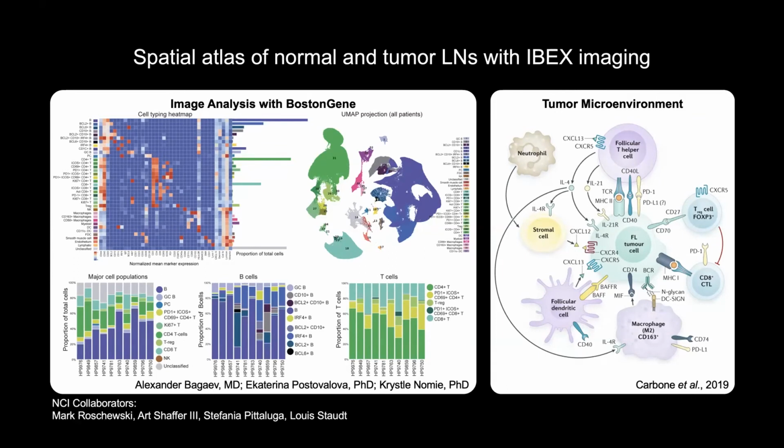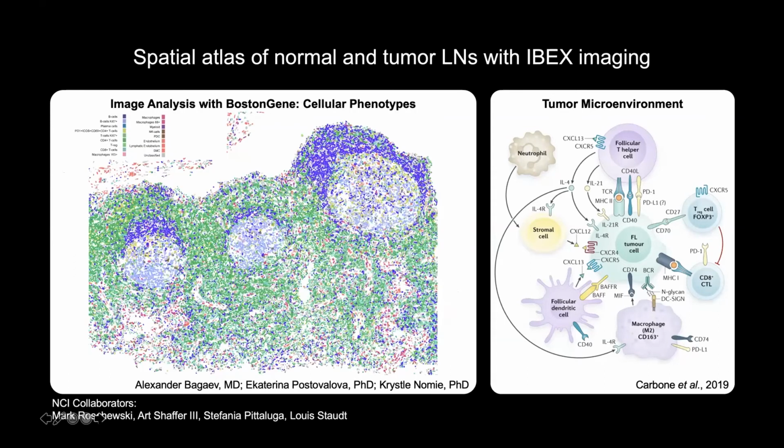And then it comes up in the analysis and we can go into the image and see that that population does indeed exist. And so, similar to Monica, yes, indeed, we can take these segmented cells, pseudo-color them based on their phenotype and, because we have the spatial coordinates, put them back in their native tissue context. And here's a normal lymph node, and we can see 3 different secondary follicles with germinal centers shown here, here, and here, and already you see a diversity just in germinal centers, just in normal tissues.